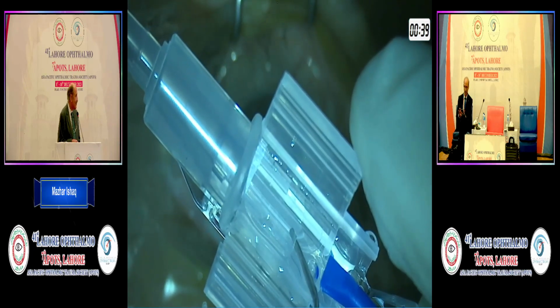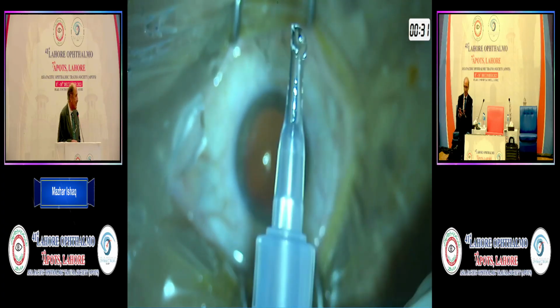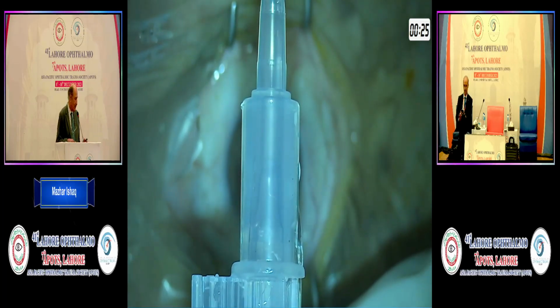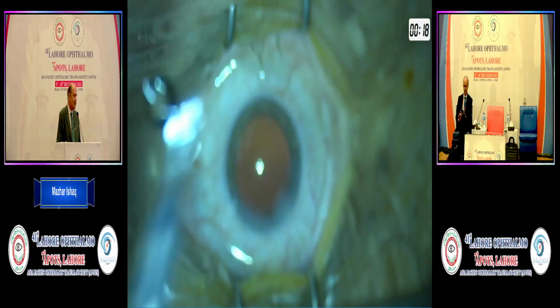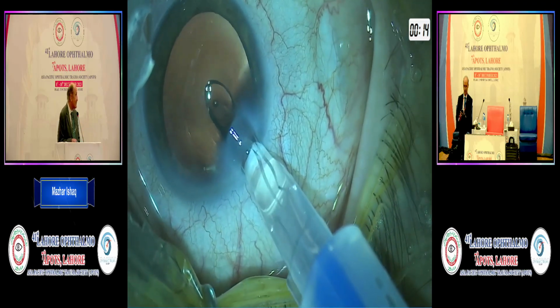So you put some hot normal saline in it, and it is more rigid as compared to your normal trifocal PanOptix or any other lens you see. Otherwise, it has a small lock, and when you remove it, it opens a bit more slowly as compared. So there is a slight learning curve if you are going to start this lens.